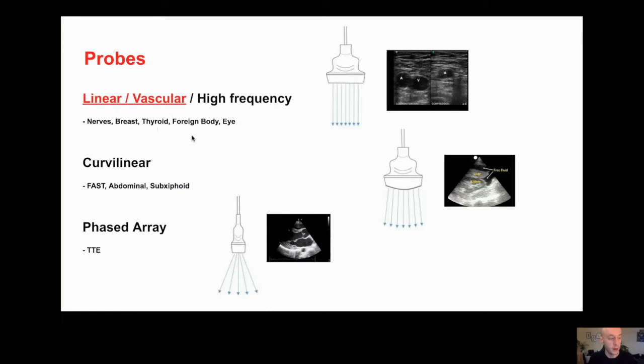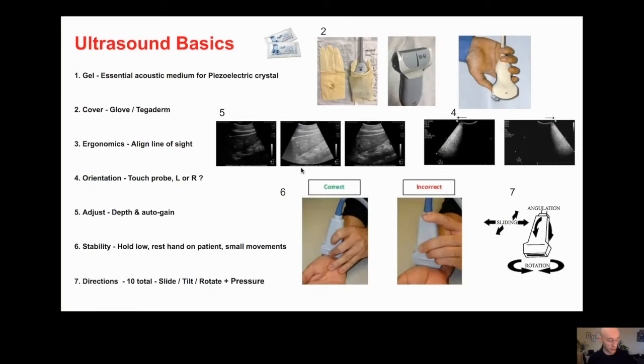And I remember that for, when you're maybe at a music festival and you can hear music in the distance, it's the low frequencies that you can hear because they travel further. It's the bass that you hear. You don't hear the high pitch stuff. The phased array probe is the echo probe, and it's because it is small enough to fit in between the rib spaces.